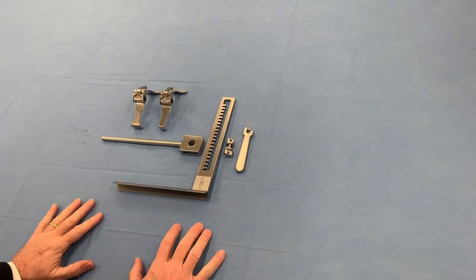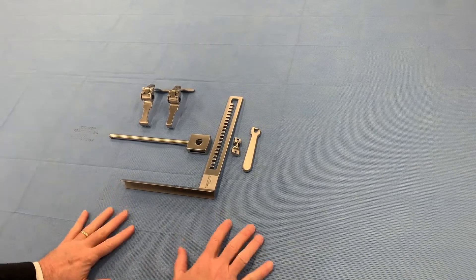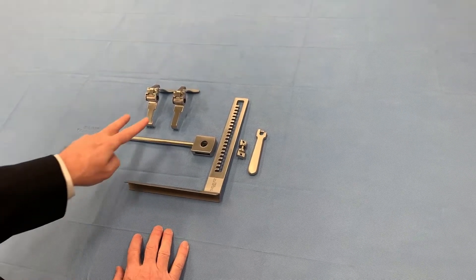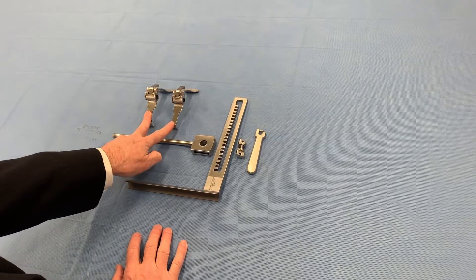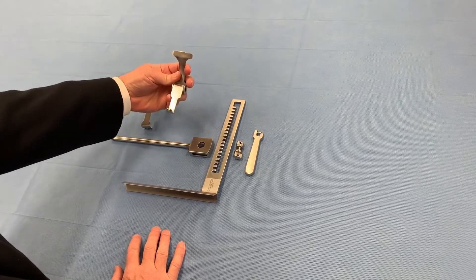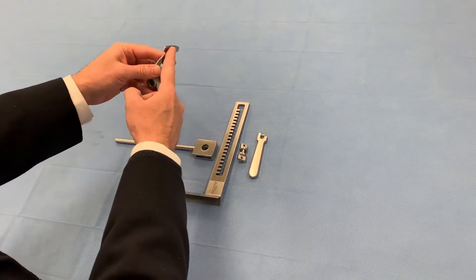Today we're going to assemble the Pilling Coutille IMA Retractor. It comes with two blades — chest blades. One is wider, one is narrow, and it has an atraumatic end and a paddled end.